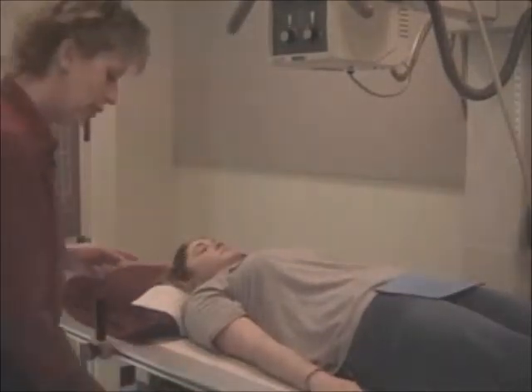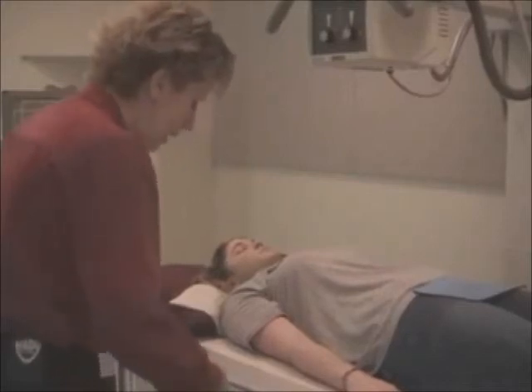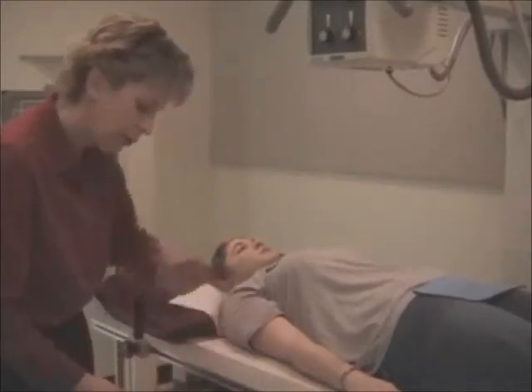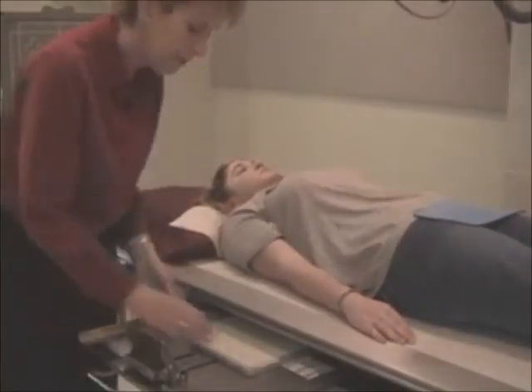What way should I put the cassette, gang? Crosswise. APs and PAs, the film goes crosswise. Again, the ID blocker will be towards us. Her fundus is here and her pylorus is here.